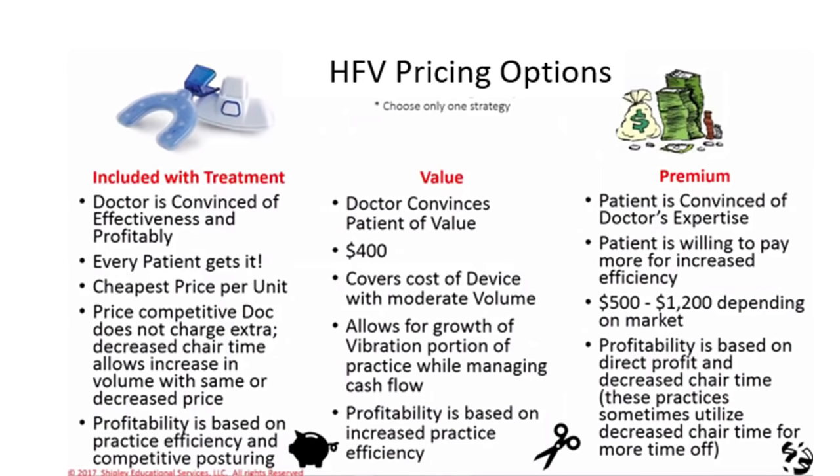So the first option would be included with the treatment. I really think that when we include it with treatment, this is for the doctor that is convinced of its effectiveness and its profitability. You're probably not going to do this unless you're absolutely convinced that you're getting amazing results with it, because you would be paying for the device and giving it to every Invisalign start that you have at no extra cost. So the good news is every patient gets it.